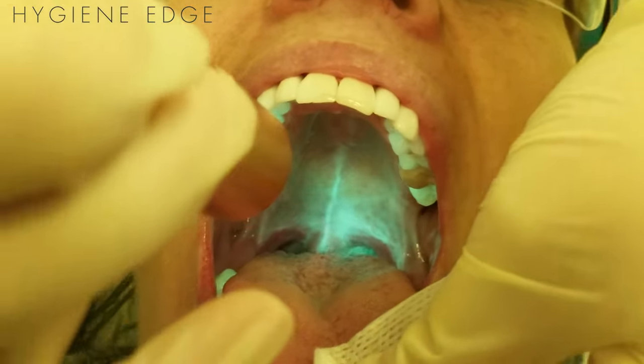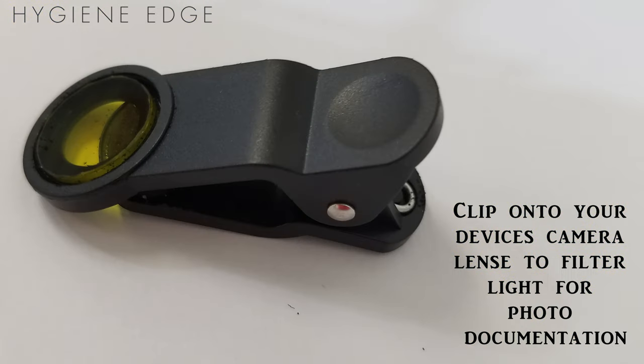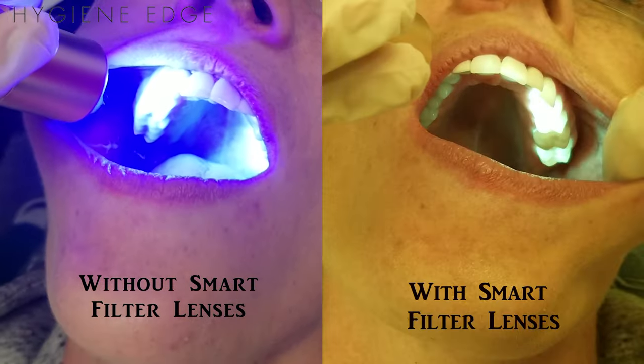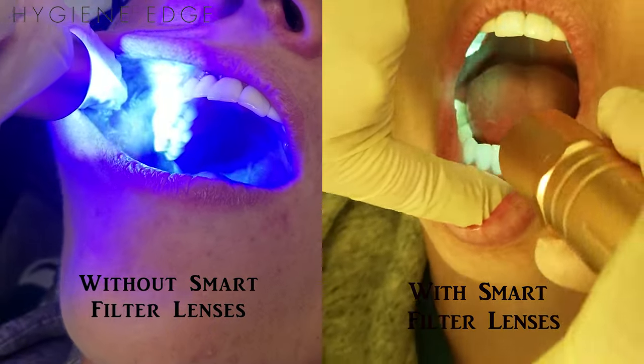One awesome feature is that for areas of suspicion, you can take a photo with your mobile device by placing the smart filter over your camera lens. This allows you to easily document and record abnormalities, compare them at re-evaluation appointments, and collaborate with specialists.